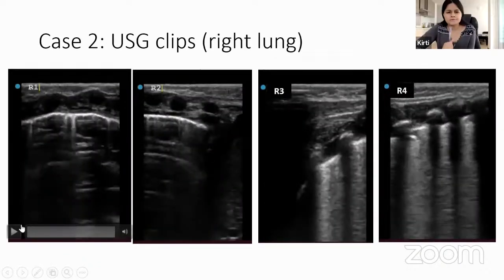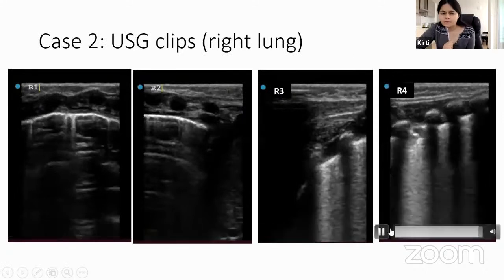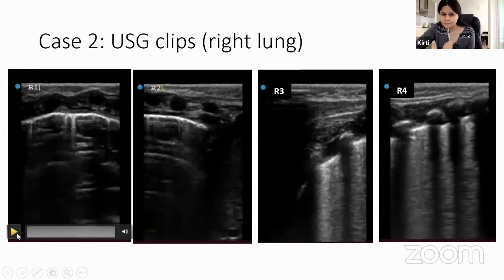Yeah. In L2, do you think that on the left side, there's also some loss of contact? Because when I did it for extreme preterms with that linear probe toward the lower side, there was always not enough chest space to accommodate that. And I had these blackouts.